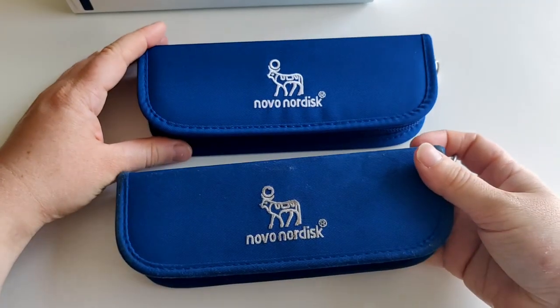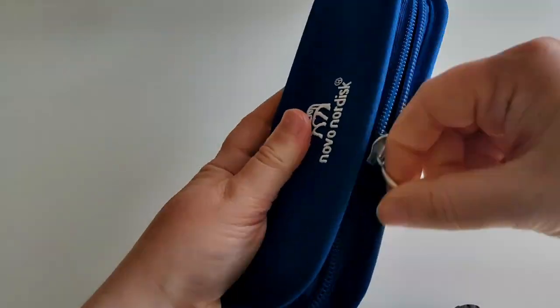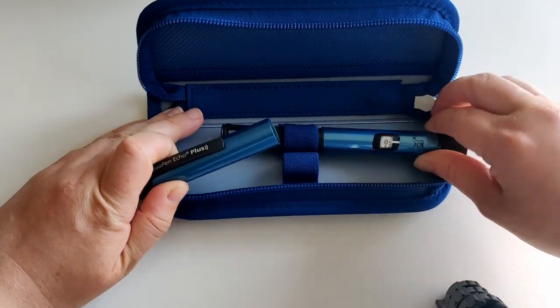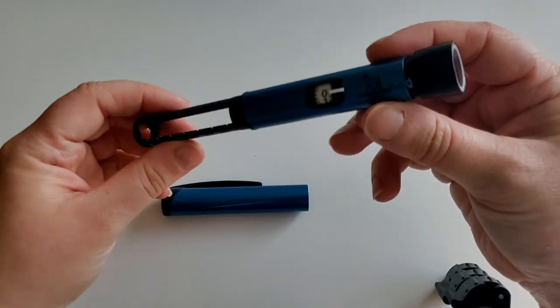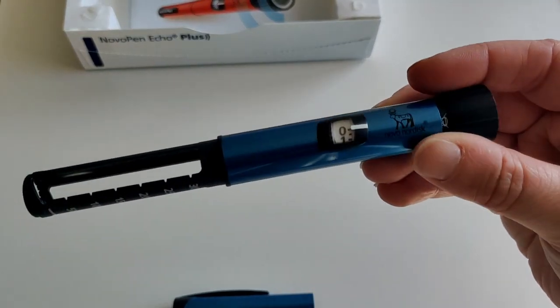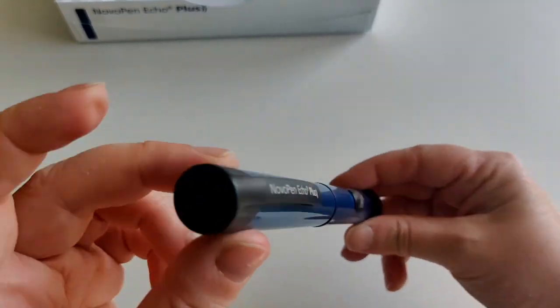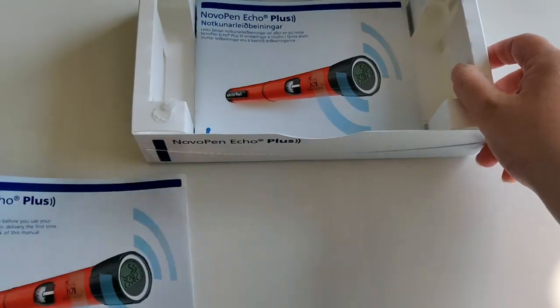First glance it is looking very similar to my current pen. It comes in the traditional case they always have, looking fresh and new and really nice. It says Novo Pen Echo Plus and looks very nice and shiny. Getting it out to have a look — first glance I'm noticing this is way more thick than the previous pen. I will in the future do a whole video comparing all different pens. First glance, it's much thicker, but everything else looks the same — even the way it closes — and it says Novo Pen Echo Plus.